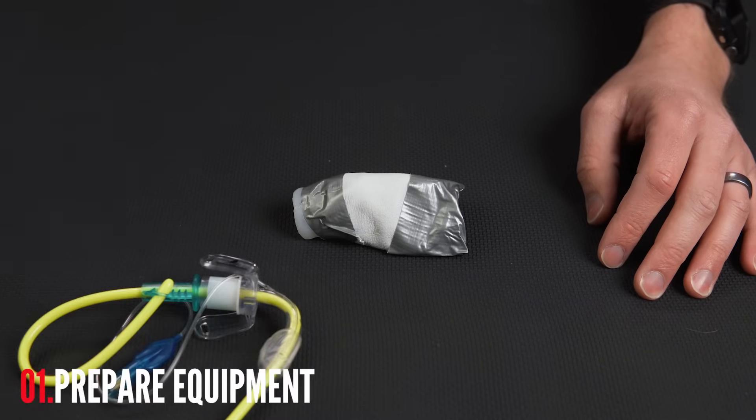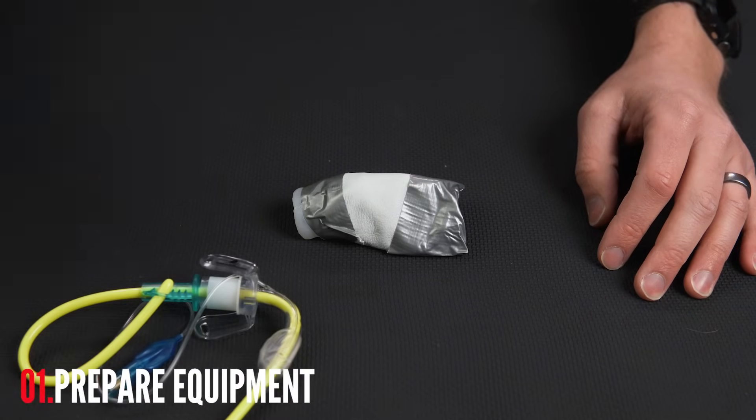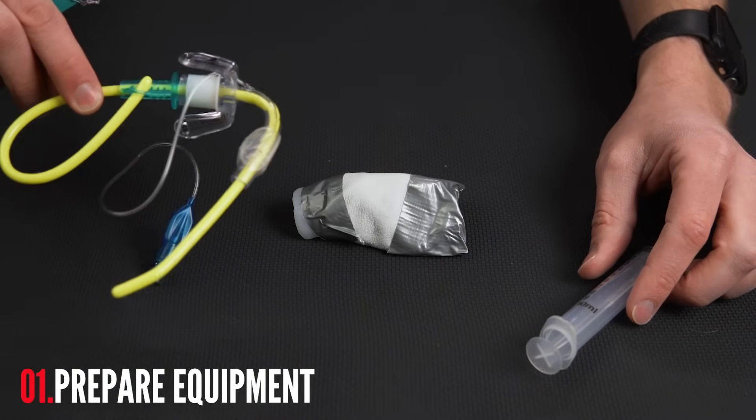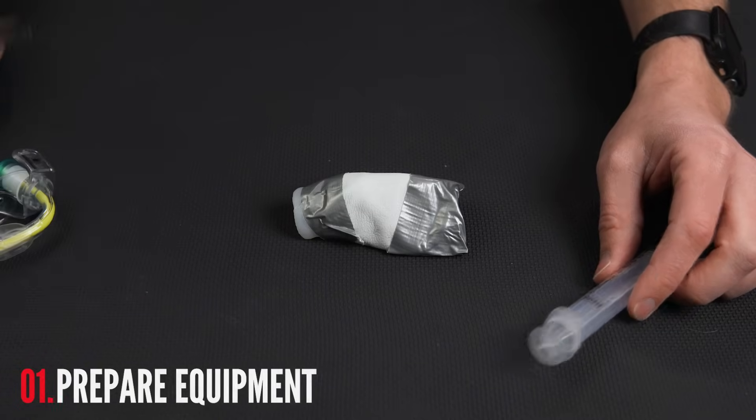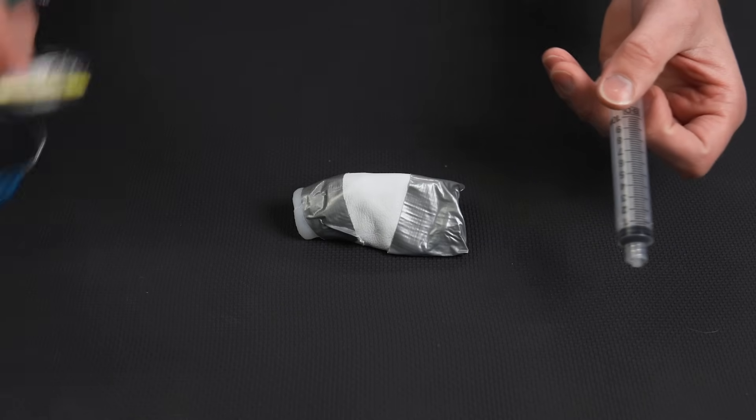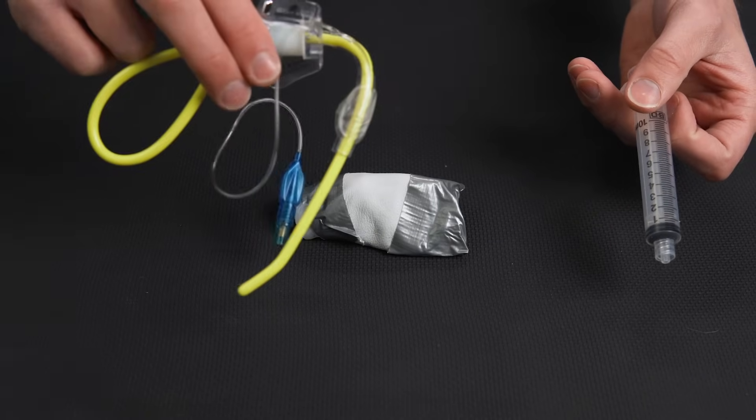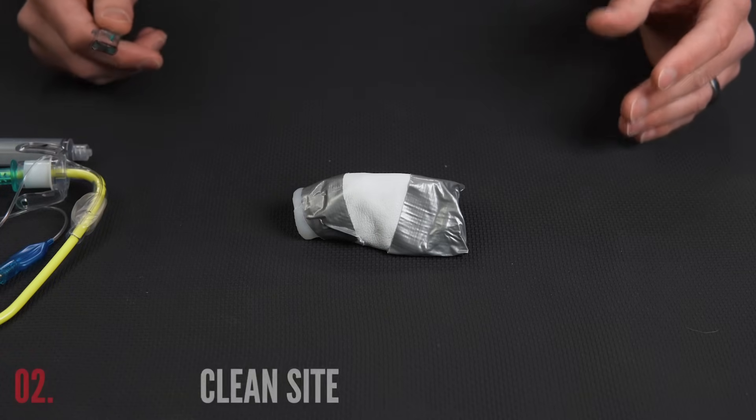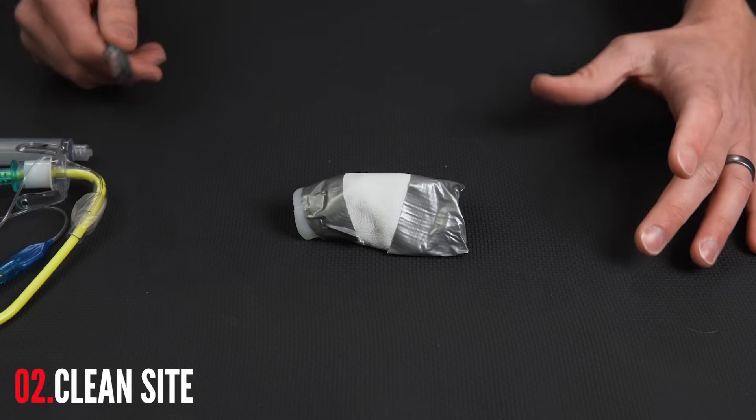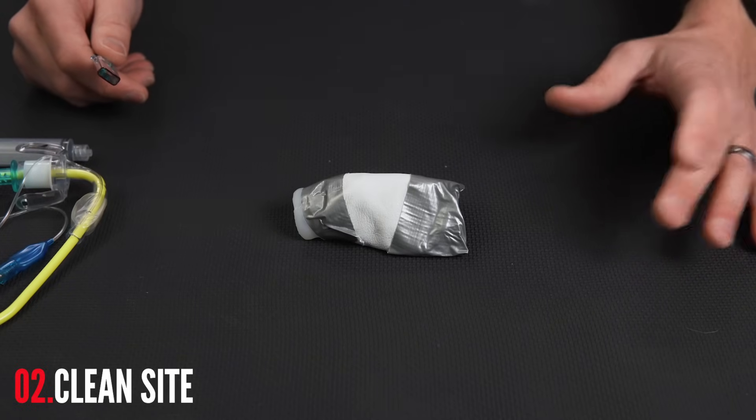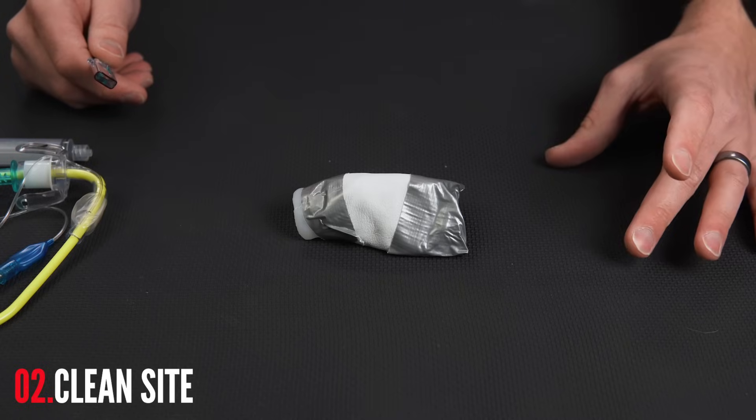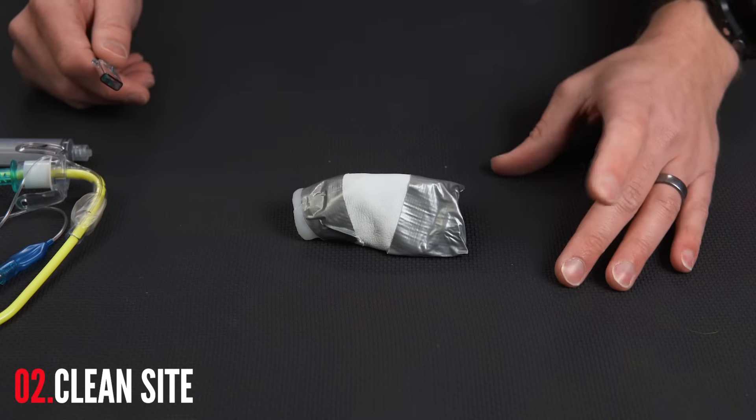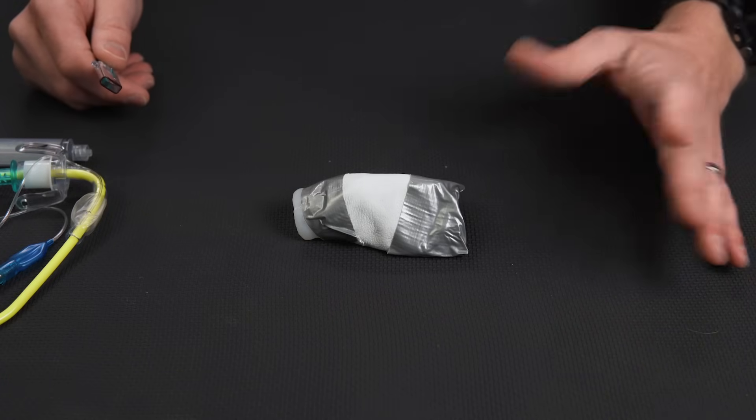For this guy here, it's the same tools we were talking about earlier. I have the bougie preloaded in this. I think that makes it a lot easier. We've already tested the lumen on this to make sure it will actually hold when we put it in place. Textbooks will tell you that you're going to want to sterilize the site here. In my experience, if you're performing this procedure, an infection after the fact is kind of the least of your worries. You're just trying to get that airway.